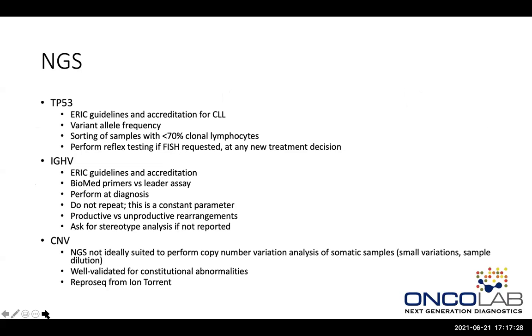Okay, quickly through this, the TP53 we do with a specific kit. TP53 guidelines through ERIC and accreditation for CLL is available.